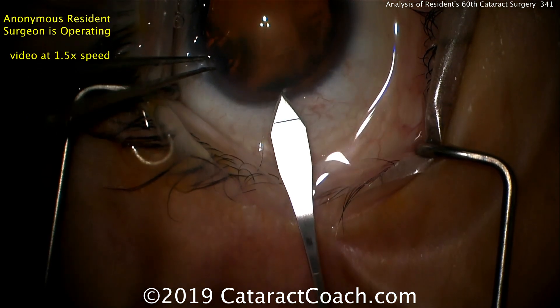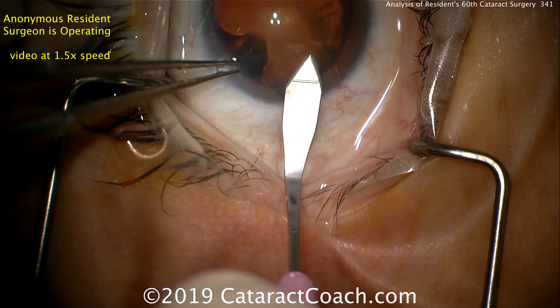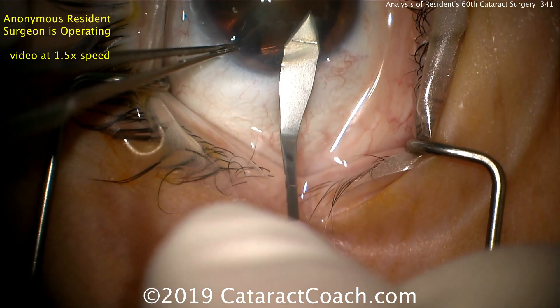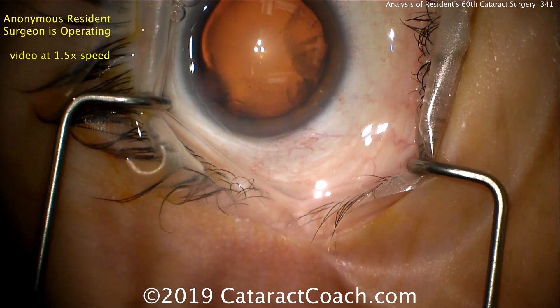Now fixating the eye with forceps, and here's the keratome entering the eye, and now using the keratome to widen the incision. This is kind of inexact, and it's probably a better move to use an appropriately sized keratome instead of just sawing the incision wider. But it looks still reasonable.